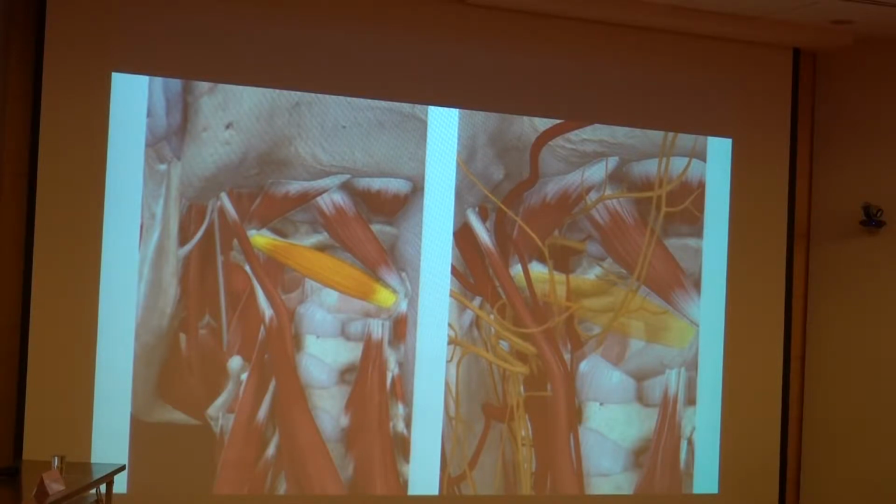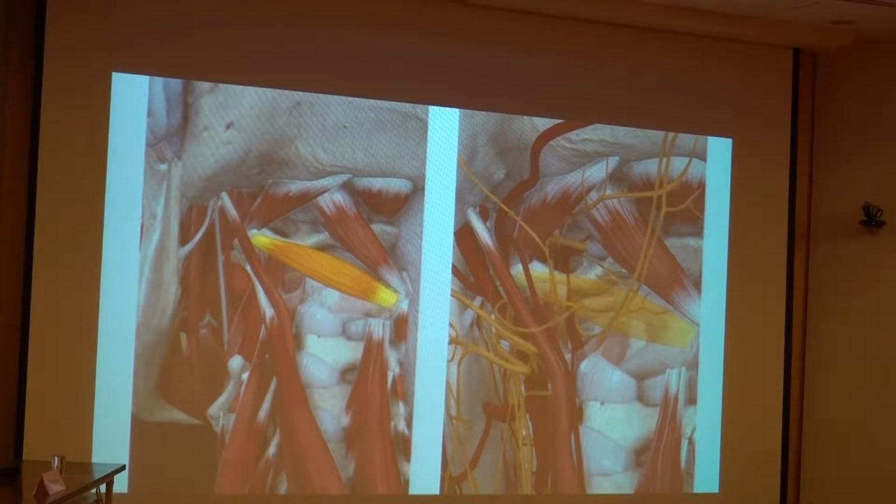In fact, for a nerve to supply an area, there are branches going above it and going below it. So when you look at those muscles, the muscle fascia outside the nerves, basically you are seeing the suboccipital nerve. It's basically surrounding the muscles. So remember that you're looking at the fascia, looking at the layer above and below it.